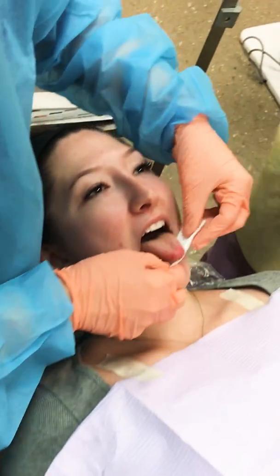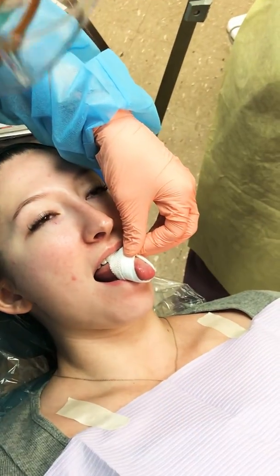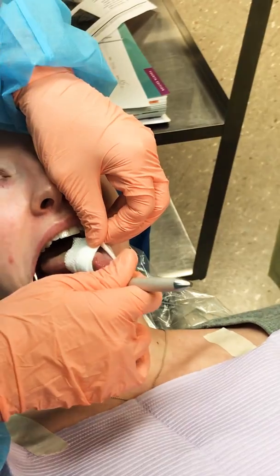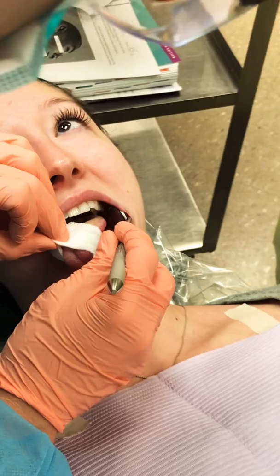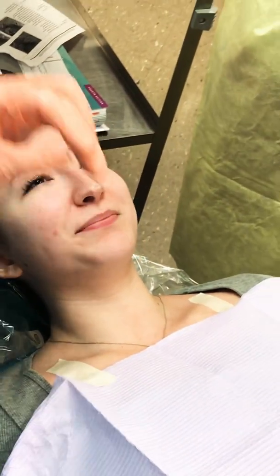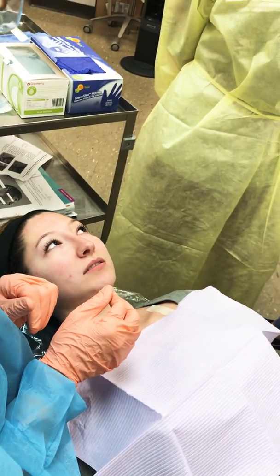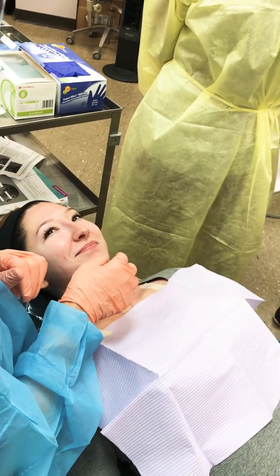All right, let's put the tongue out for me. I'm gonna lasso it up — you don't have to stick out quite so far. And just take a peek way back at the back of it, making sure everything looks okay. And then I'm gonna pull it to the other side and look all along the lateral border, make sure everything looks okay. When you have a patient that has a really tight frenum and you can't really do that, you just try to get your mirror back as far as you can, and you don't pull hard because it'll hurt.